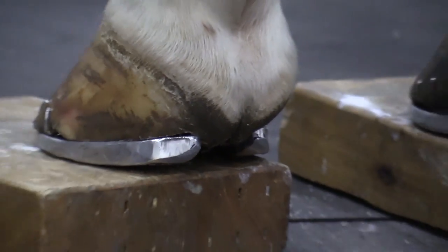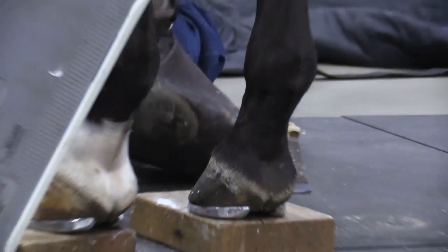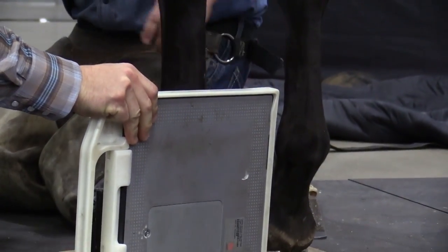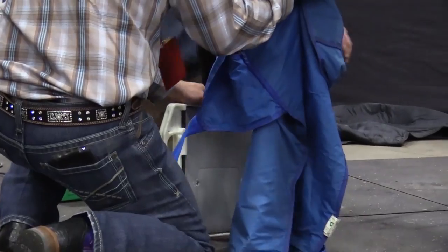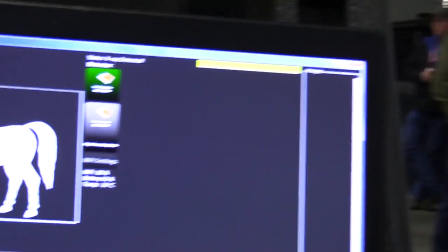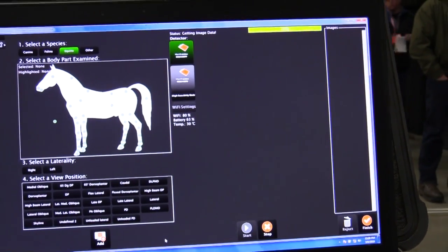What do we need to do to the X-ray machine? You going left or right first? Doesn't matter. Make sure you're standing good. Take your paper. Yeah. There you go. That way we want to readjust. X-ray detected. Getting image data.